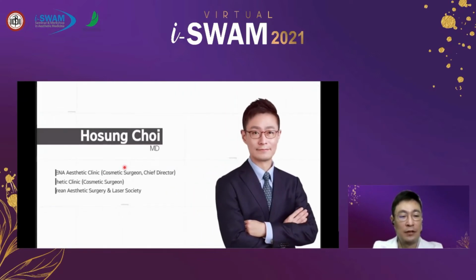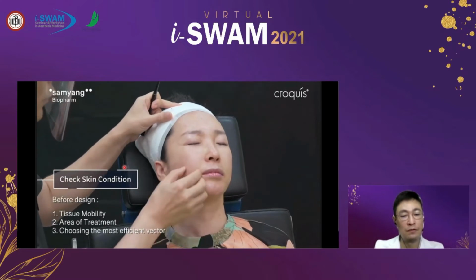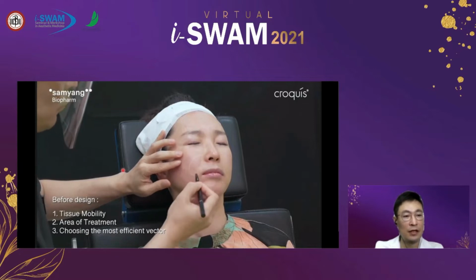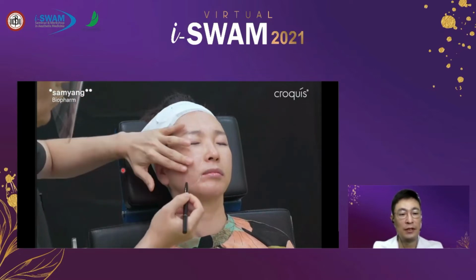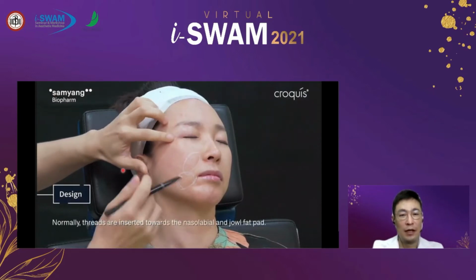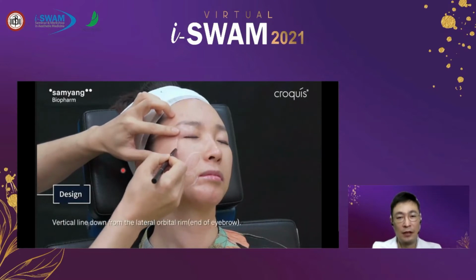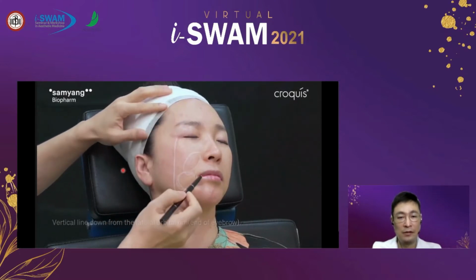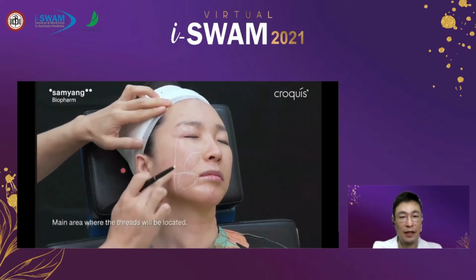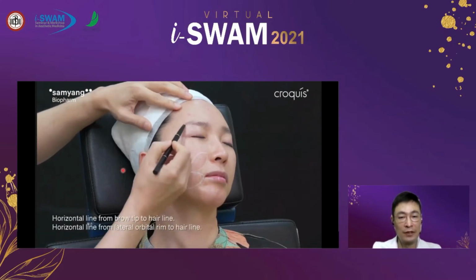Now let's have a look at a short video about lower face lifting using various threads. First, I checked the tissue mobility and asymmetry. Usually the routine is that I draw two lines, line C and D, and I choose the area to be treated, to be lifted.